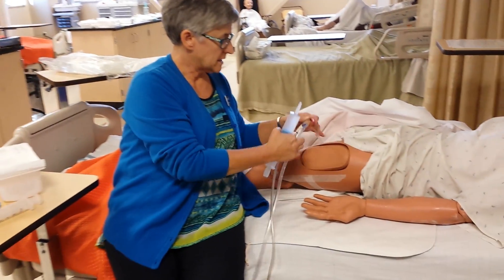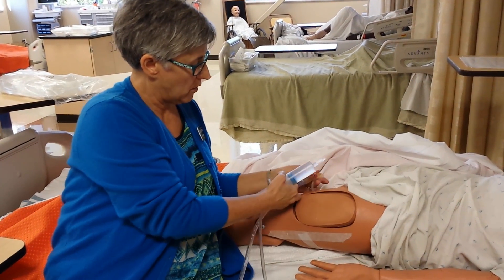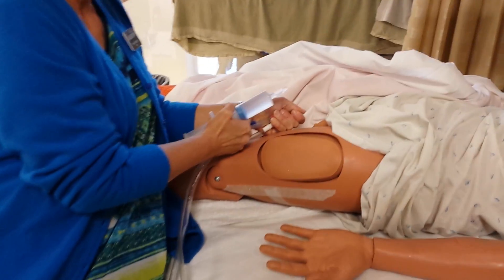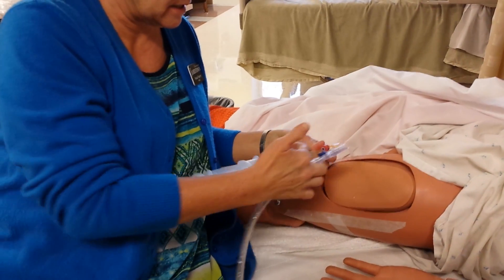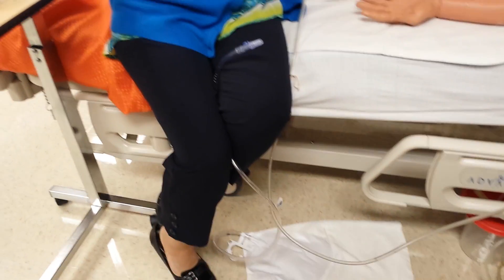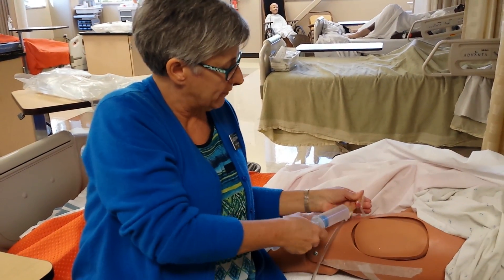Now, my open system is what Dr. Bates had talked about with the catheter tip piston syringe. So I'm clamping this off while I'm taking it apart, keeping the ends of this sterile, and I'm going to put my 60 mils of sterile normal saline in here, keeping this sterile as well. I probably need my assistant. And I'm going to forcefully irrigate that catheter and pull back again — I've got great flow now.